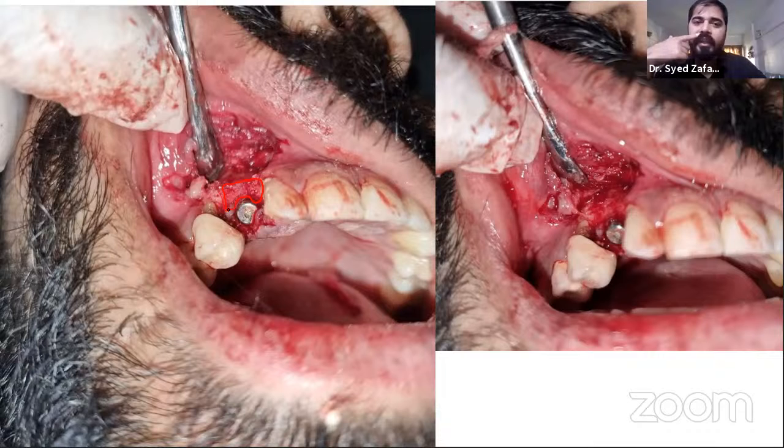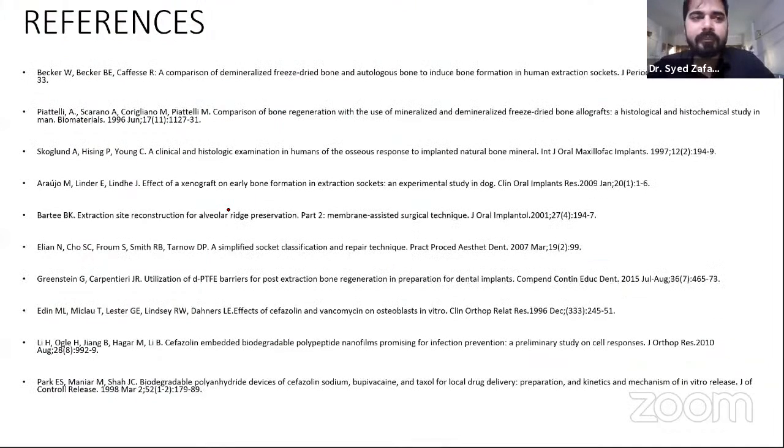You can see the titanium coming out from the soft tissue. A great advantage comes with also a great disadvantage. Titanium had this kind of disadvantage. You need a second surgery. But with an absorbable membrane, you never need a second surgery. But if there is bone formation.